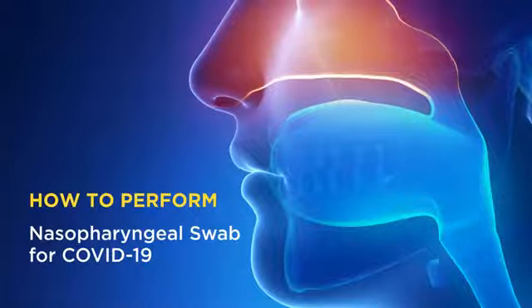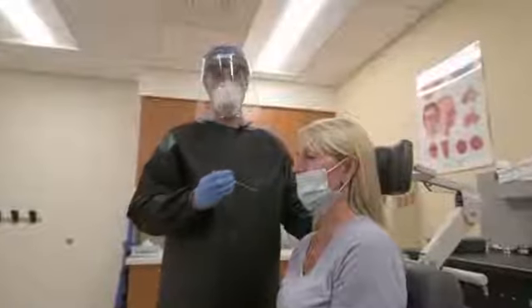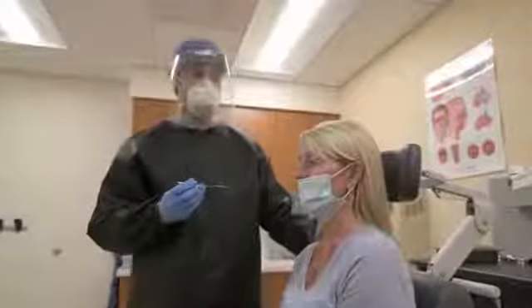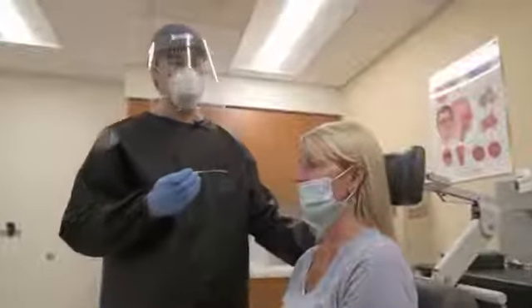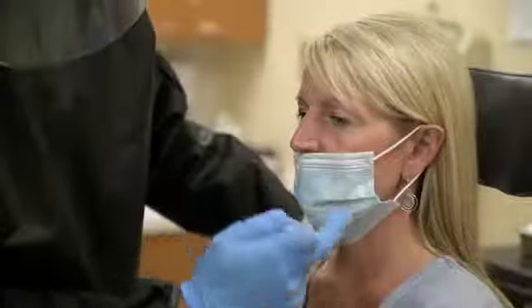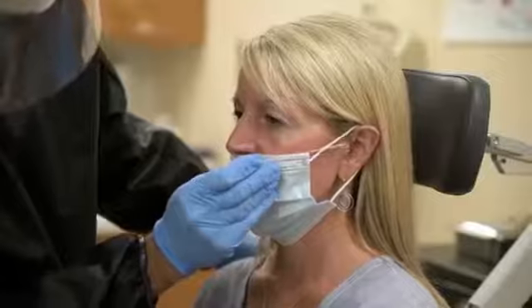Prior to performing the nasopharyngeal swab, ensure that the patient's mask is still on and covering their mouth, as this will protect you from any inadvertent coughing or sneezing during the procedure. To estimate the length of insertion to the nasopharynx, simply measure from the nasal ala to the ear canal. It's about 7 to 8 centimeters back from the nasal opening.